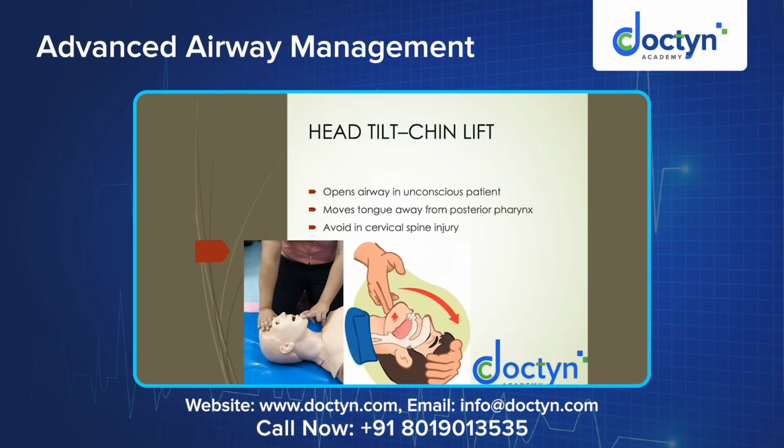As we discussed in the previous class, I'm just brushing up on the maneuvers because the next airway adjuncts will also cover this part. So, head tilt and chin lift. These maneuvers are done to open up the airway. As we discussed in the last class, the tongue falling back is the most important factor which causes airway collapse. Once the airway starts to collapse, even if you supplement air through an AMBU or bag mask ventilation, the air will not cross the oral cavity and reach the lungs. That causes airway collapse or airway failure.